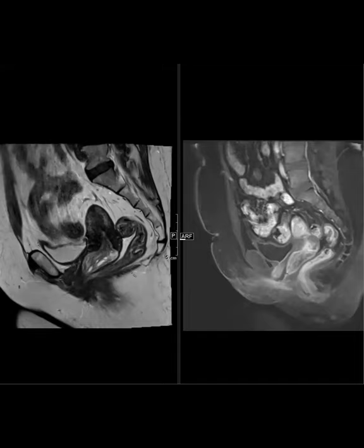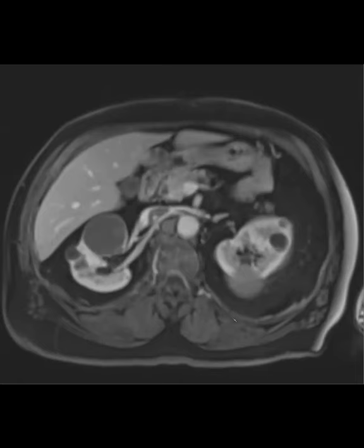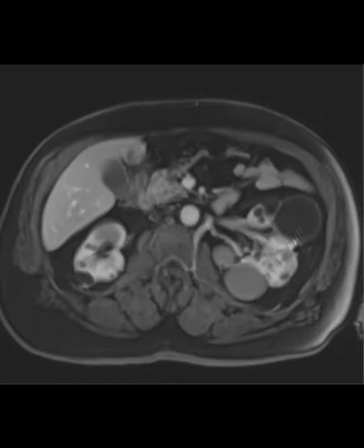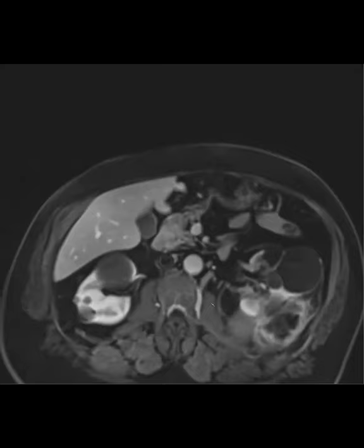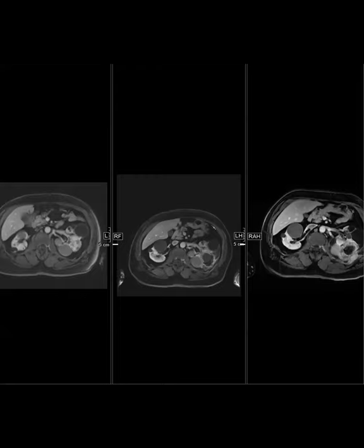And then I do have one more case. This was cool. This was a patient who had multiple complex renal lesions. Some were simple cysts, some were proteinaceous or hemorrhagic cysts. And they had this more solid enhancing mass in their interpolar left kidney. So they decided to ablate it. They did cryoablation. This was actually 6 months after cryoablation. This is what the site looked like. And then another 6 months later, it looked like this.